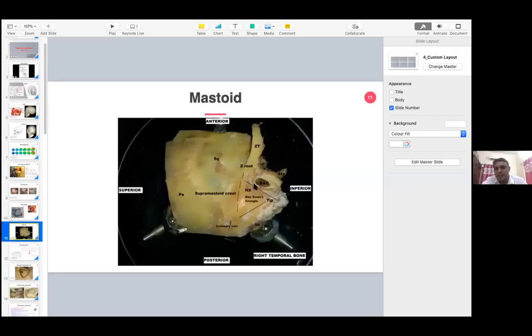You drill exactly parallel and posterior superior to the bony external auditory canal. You enter from the mastoid cortex here and go into the middle ear via the facial recess. And you are always drilling lateral to the incus. Once you go medial to the incus, you are going to hit the facial nerve. If you are lateral to the incus, you will not have any problem.